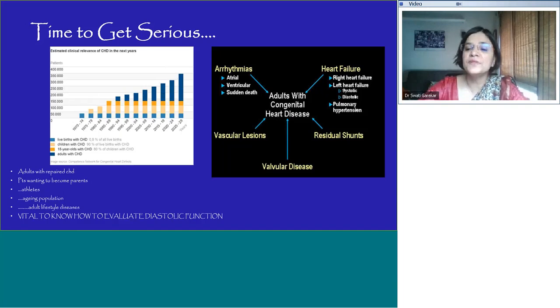A big problem with them is also heart failure, and failure obviously means systolic and diastolic failure. So we have to know how to evaluate diastolic function. We need to know what the adult world is doing as far as diastology.